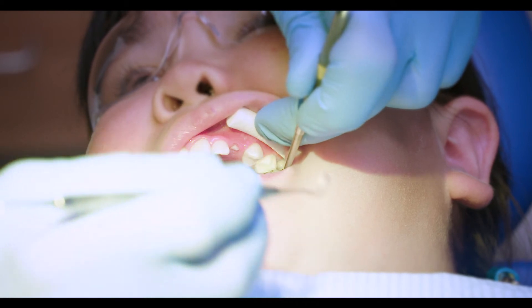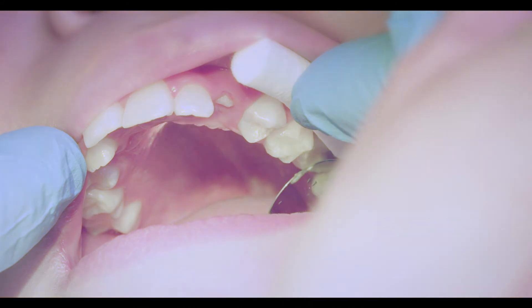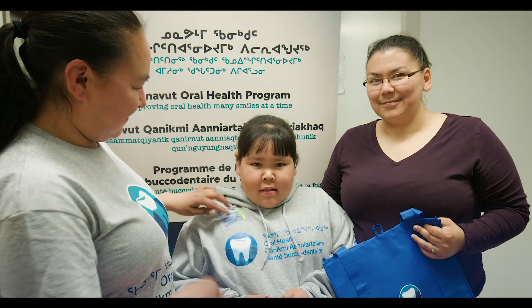The tooth is checked to see if the IST has hardened. The tooth surface will feel smooth to the tongue. This IST procedure will typically take 5 to 10 minutes per tooth to complete.